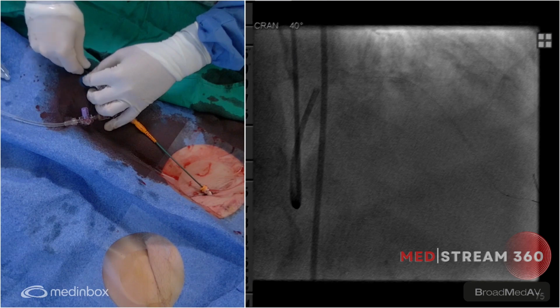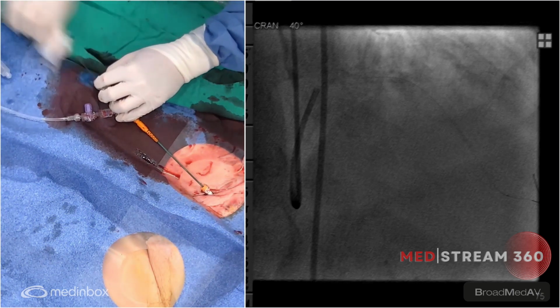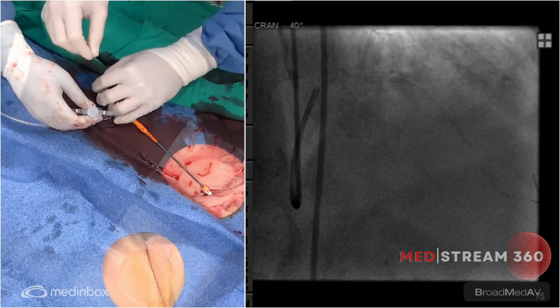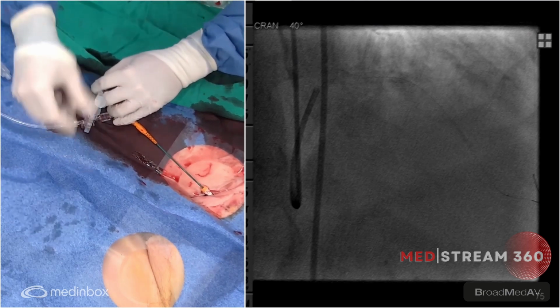Yeah, I'll give you some contrast. Go ahead. Should we try with the 2.0 first? Because do you think OCT is going to cross? I would love to get the OCT across first by itself. Give it a good shot here. Okay.